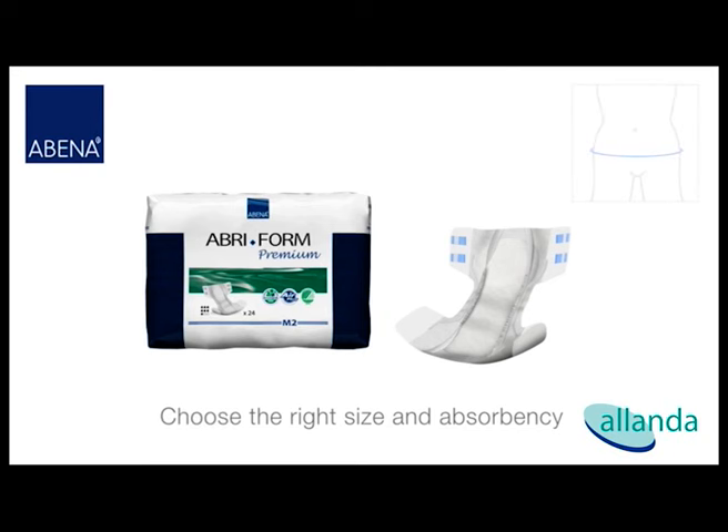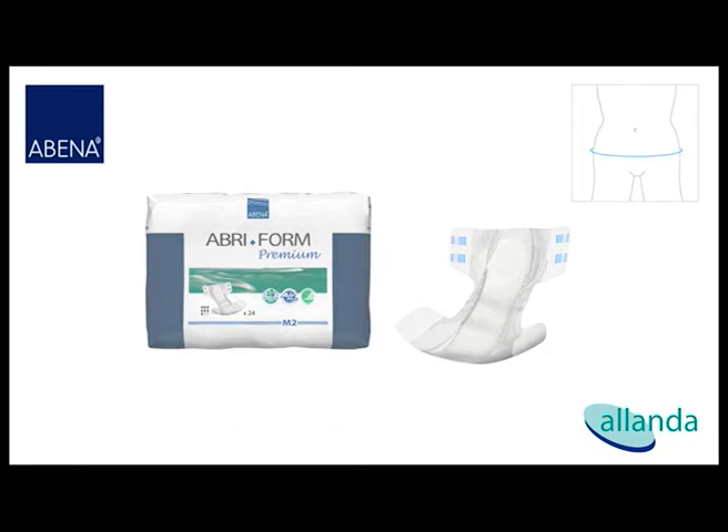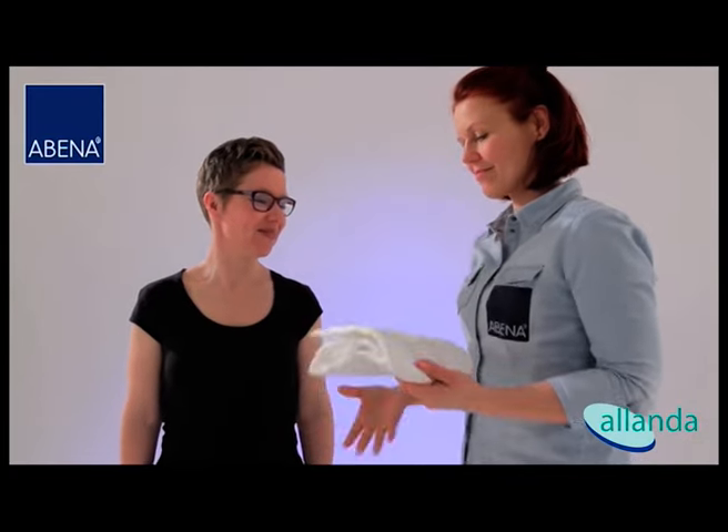To determine your size, measure your hips at their widest point, which typically lies 10 cm below the navel. Make sure the client stands as straight as possible. Provide a support if necessary.